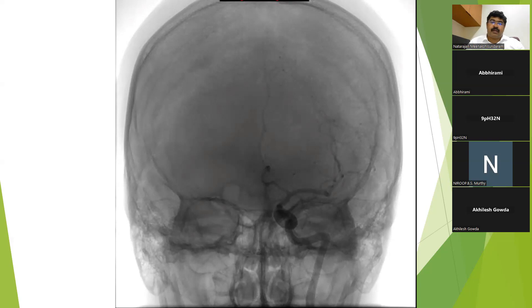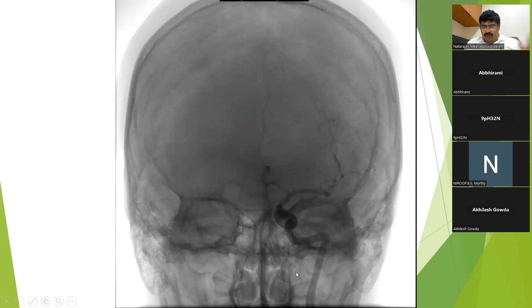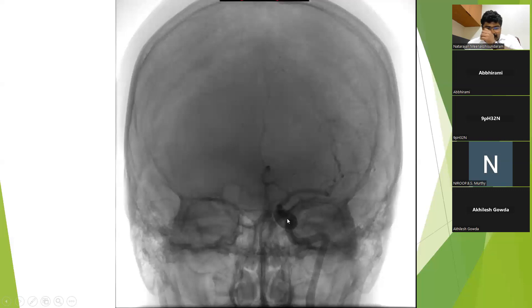The first view is the frontal projection, or the posterior anterior projection. After removing the skull and seeing only the vasculature: this is the cervical ICA, then the Petrous ICA, then the Cavernous ICA, which terminates into the medial ACA and then the MCA.